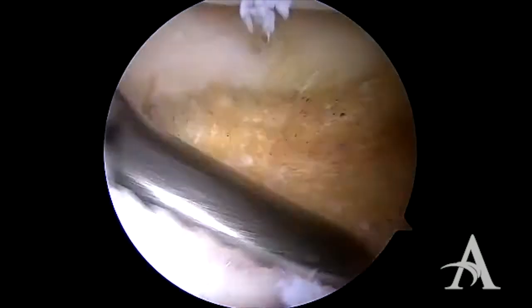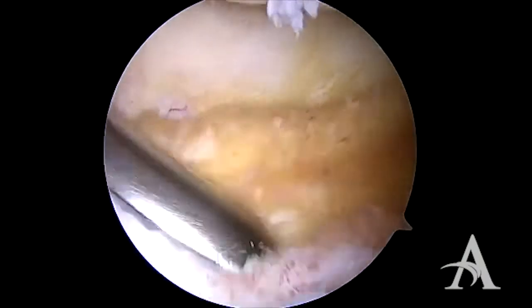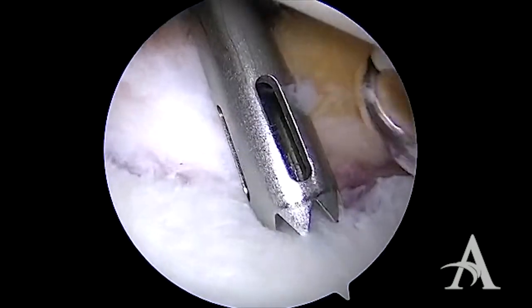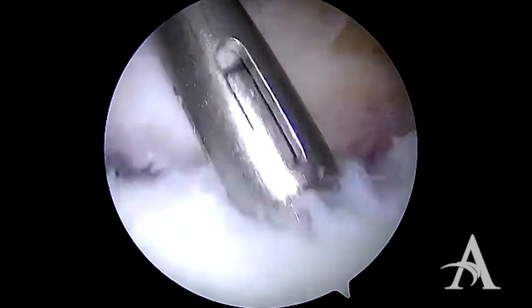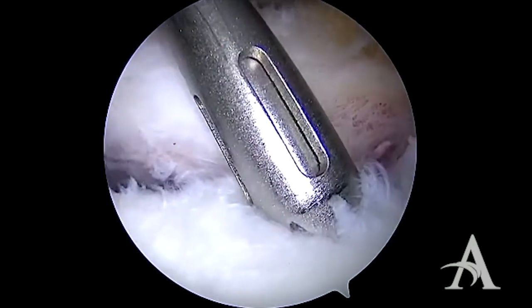Next we will bring in a rasp to stimulate a healing response. A drill guide is placed on the face of the glenoid, as inferior as possible — in this case at the 5:30 position. We then drill and tap the anchor into place. It is important that the anchor is placed onto the face of the glenoid.